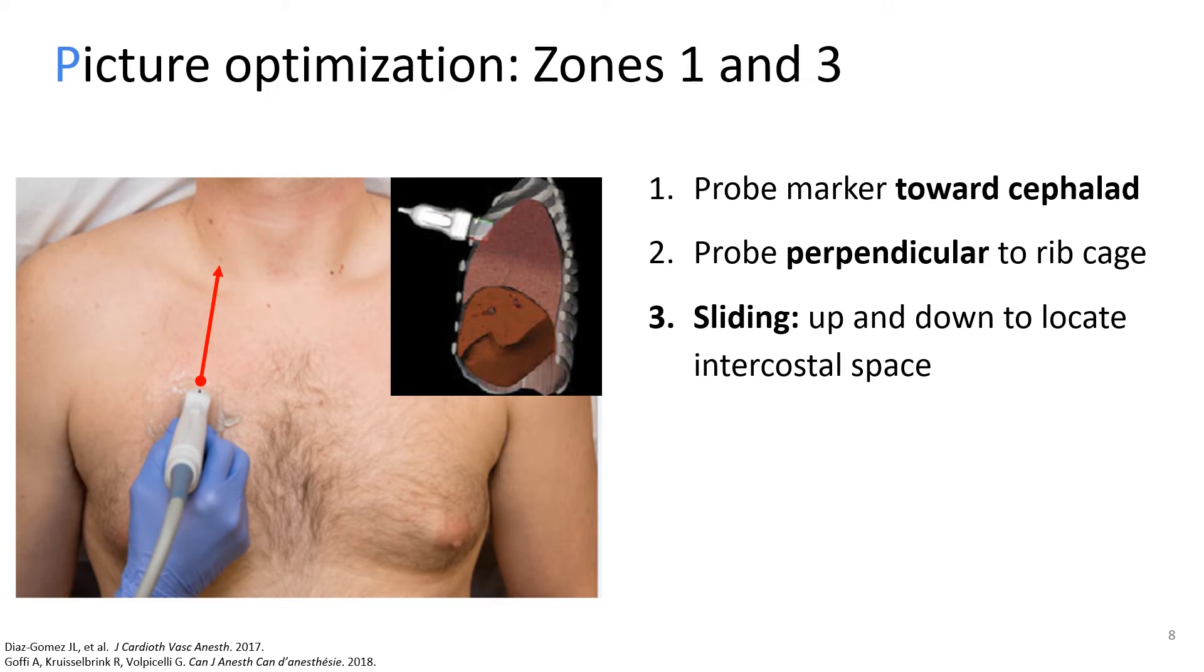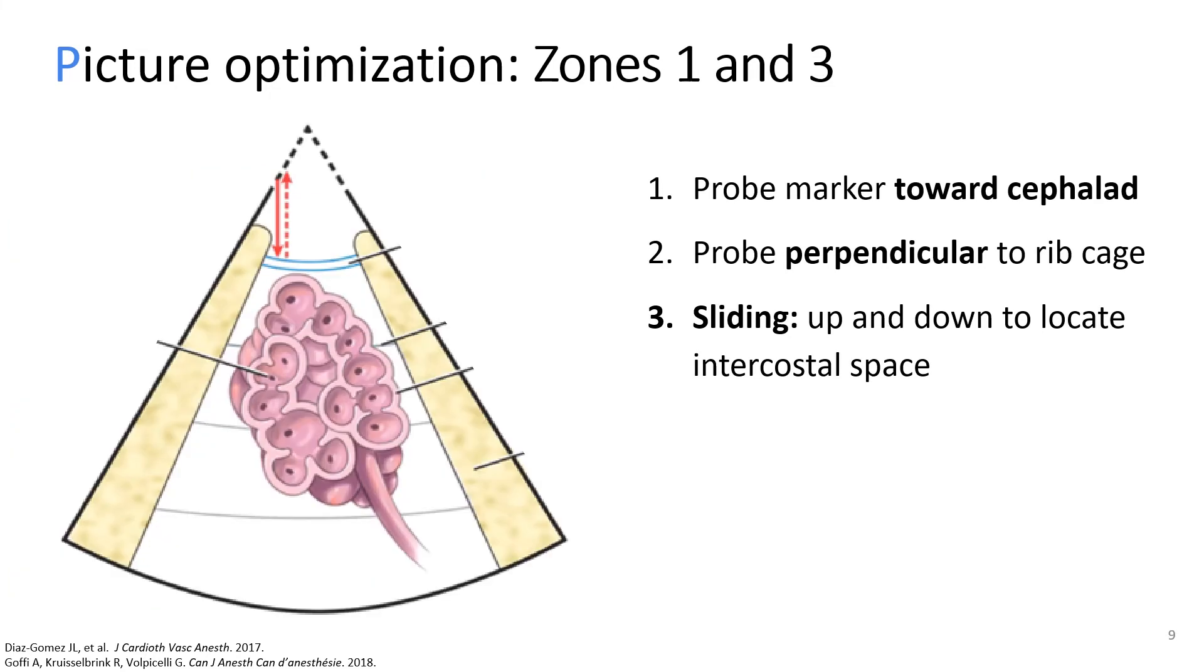But wait, how is that you can tell where you are over an intercostal space or not? Well, ribs will look like black shadows. And in between two ribs, you should see the pleural line as a bright horizontal line. The goal is to slide up and down your probe until you see an image where there are rib shadows on each side of the screen and the horizontal pleural line right in the center, just as you see in this image. You see in the center, there is the alveoli, which is air-filled. And on top of it, you see a blue horizontal line, which is the pleural line. And on each side, you see the ribs with the projected shadow. But now let's see it in real life.